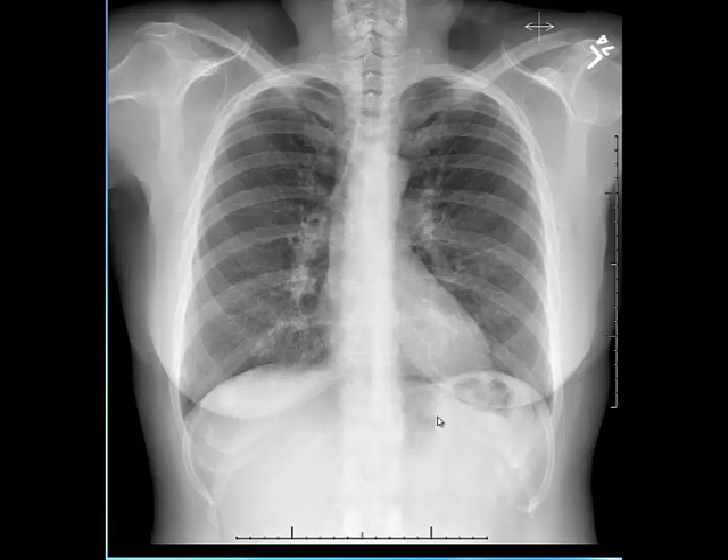Next I evaluate the cardiomediastinal silhouette — the heart and the mediastinum. I check the position of the mediastinum and trachea to confirm they are midline. I also check the cardiothoracic ratio, measuring the maximal transverse diameter of the heart and mediastinum compared to the maximal transverse diameter of the bony thorax, which in an adult should be less than 50%. Then I evaluate the lung parenchyma.